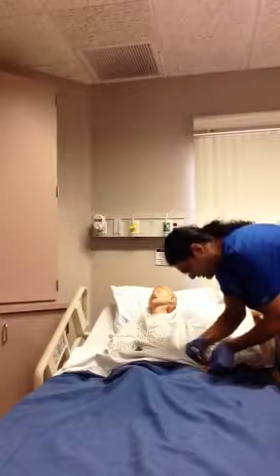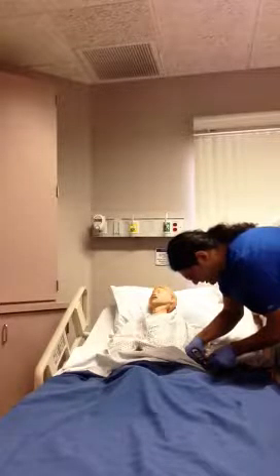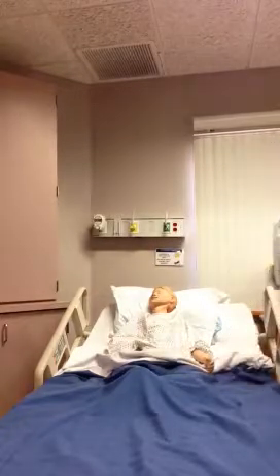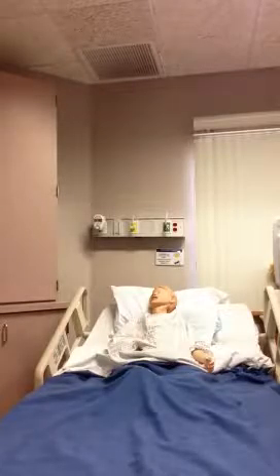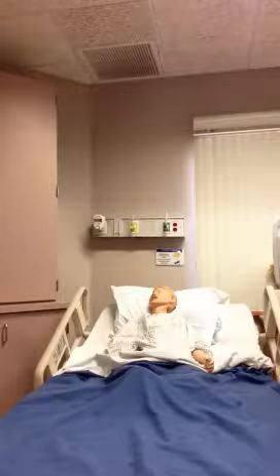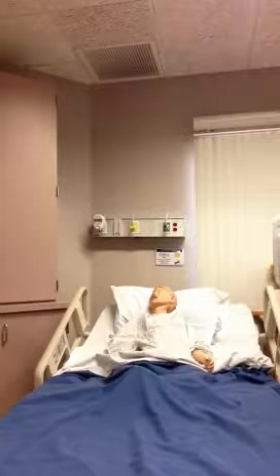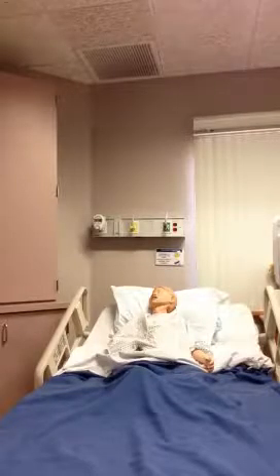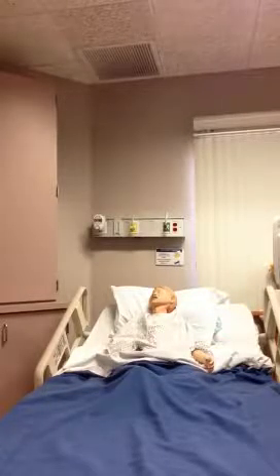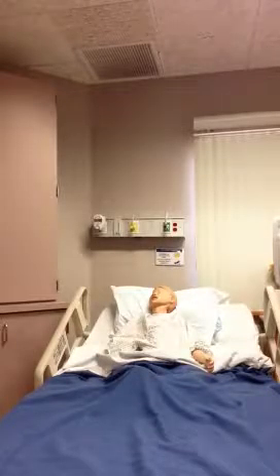I had to put that strip back on it. Let it suck it up by capillary action. Get a reading. If the reading was low, then I'd take corrective measures. Maybe give some orange juice if the patient was hypoglycemic. If the patient wasn't hypoglycemic, then I'd continue as normal. But if the patient was hypoglycemic, I would not give insulin.